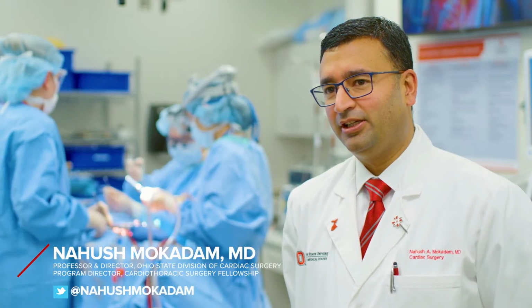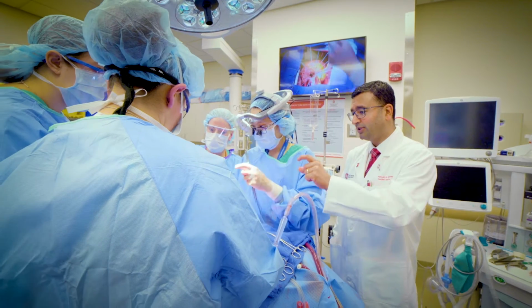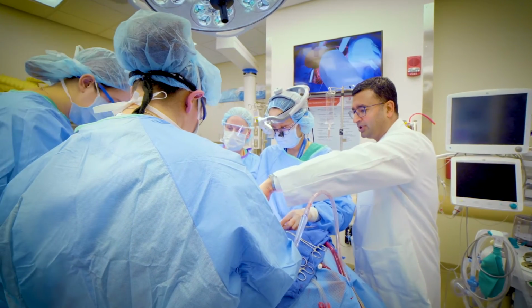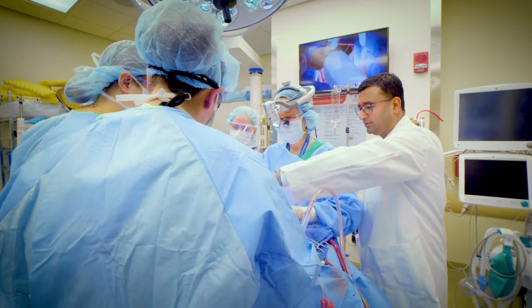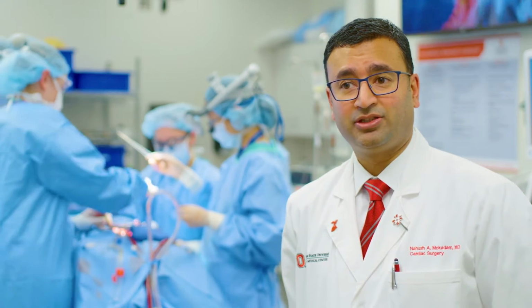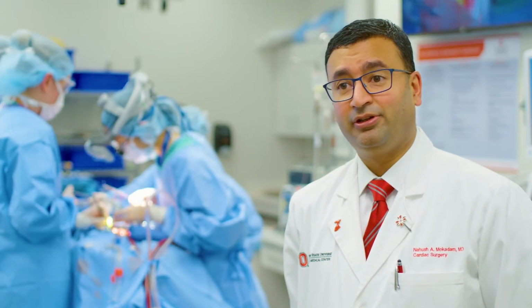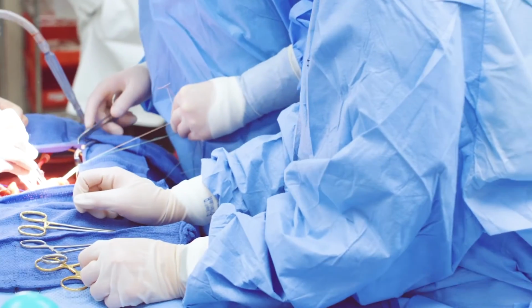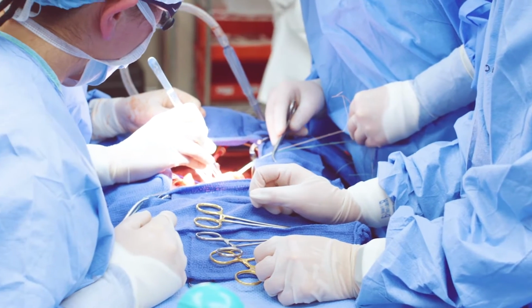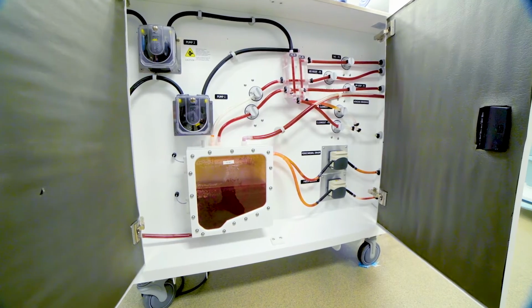Well, what we're doing here is a full year-long simulation curriculum. It's a 35-session curriculum that begins with cardiopulmonary bypass, bypass surgery, aortic valve replacement, and then 3 adverse event scenarios, including aortic dissection, air embolism, and failure to wean from cardiopulmonary bypass. In each one of these sessions, we start with low fidelity simulation and progress to high fidelity simulation.